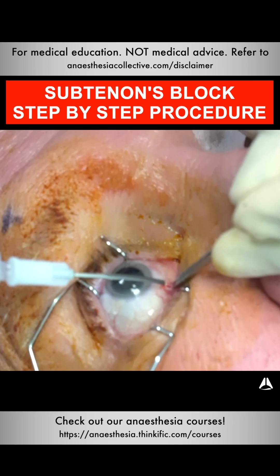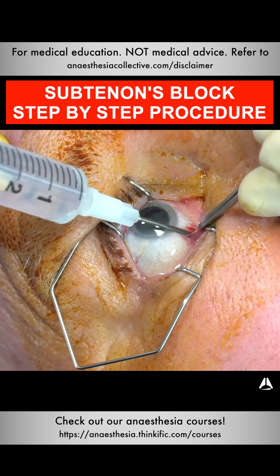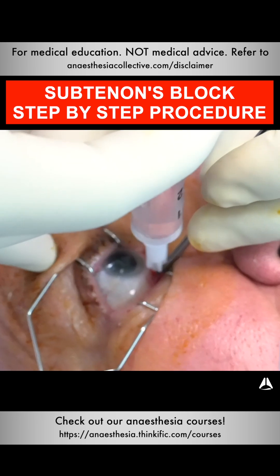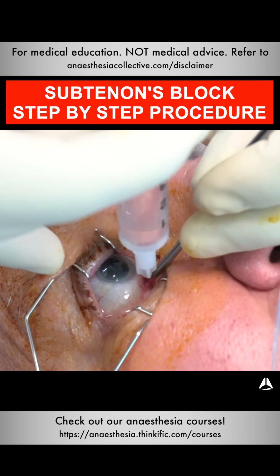I've then got the sub-Tenon's cannula syringe using a really shallow angle, going along the surface of the globe in the inframedial plane. Now I'm vertical and I just press down with my syringe to try and infiltrate. There's a bit of pressure experienced by the patient, but this is not too bad.